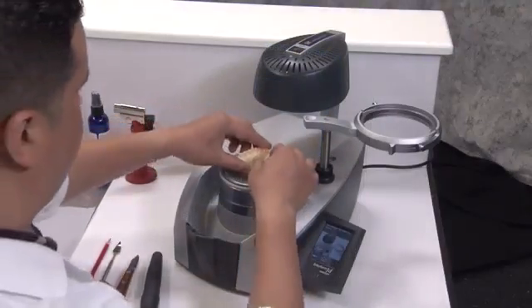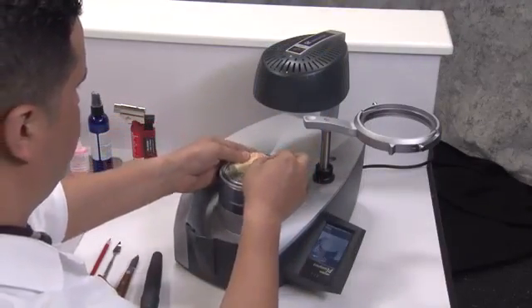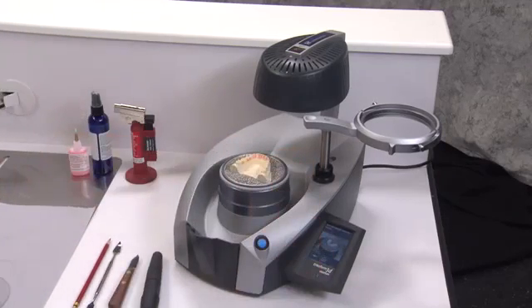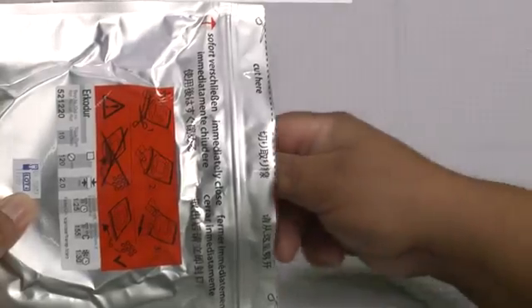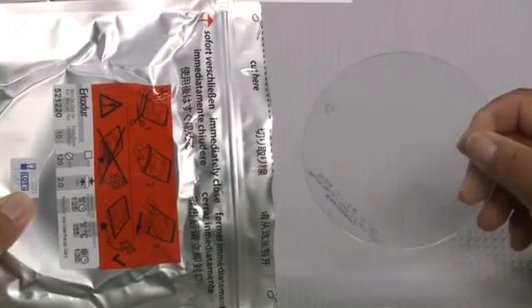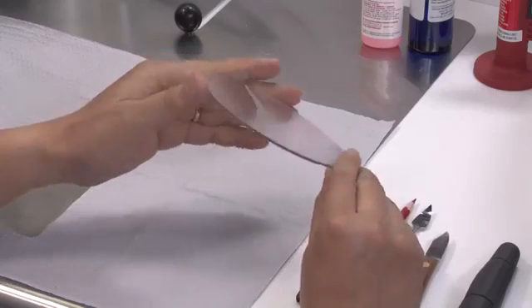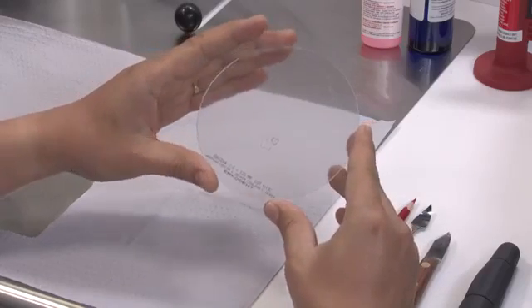Bury the base of the model in the granules. Make sure there are no granules on the rim of the pressure pot or on the teeth of the model. Remove an Erkodur 2.0 thermoforming foil from its packaging. Notice the label is on the bottom of the foil.